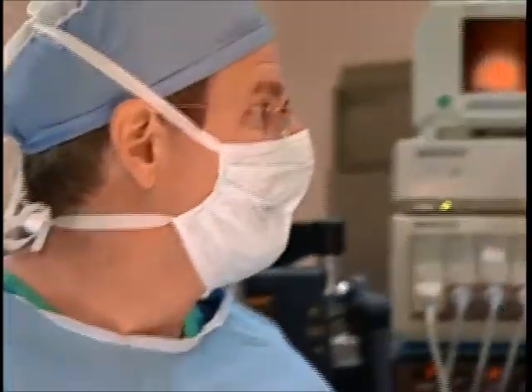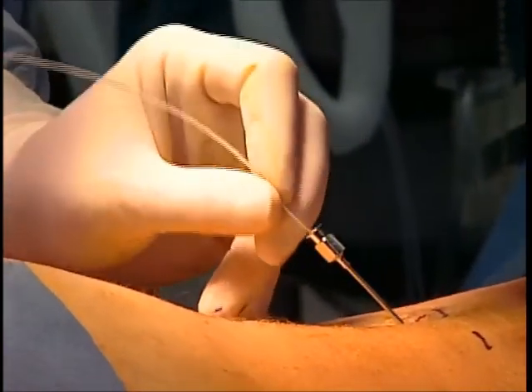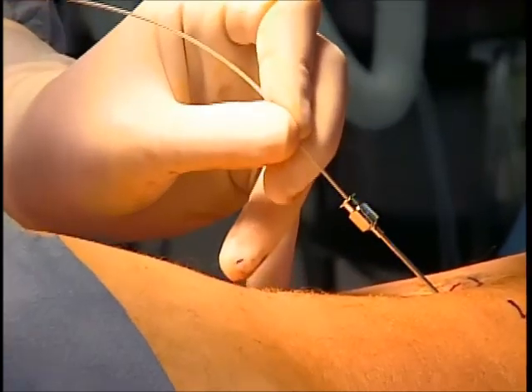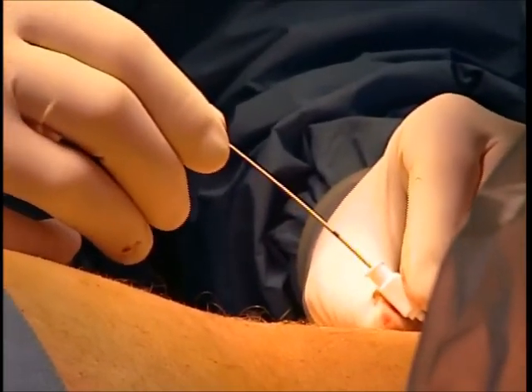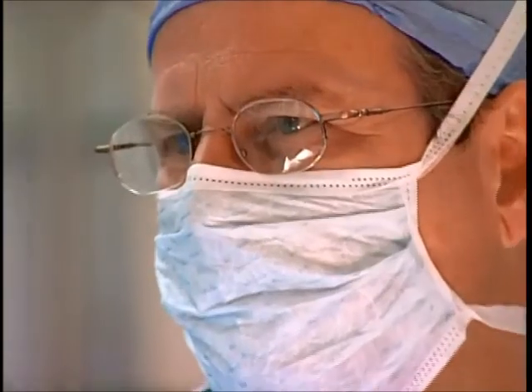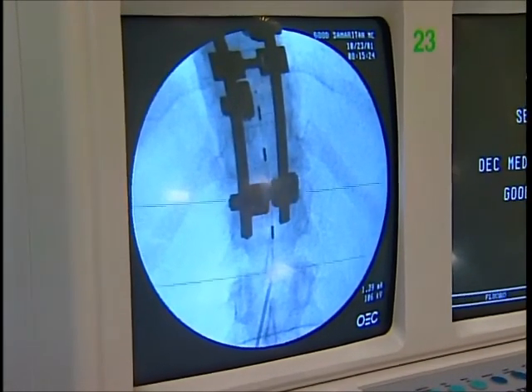After many attempts, Dr. Herbert finally manages to maneuver the stimulators through a tiny opening. The electrodes are inched higher and higher into Bill's spinal canal. With about 5 inches of wiring fed into the spinal canal, Dr. Herbert feels the electrodes are positioned properly, but they won't know for certain until power is applied and they are tested.